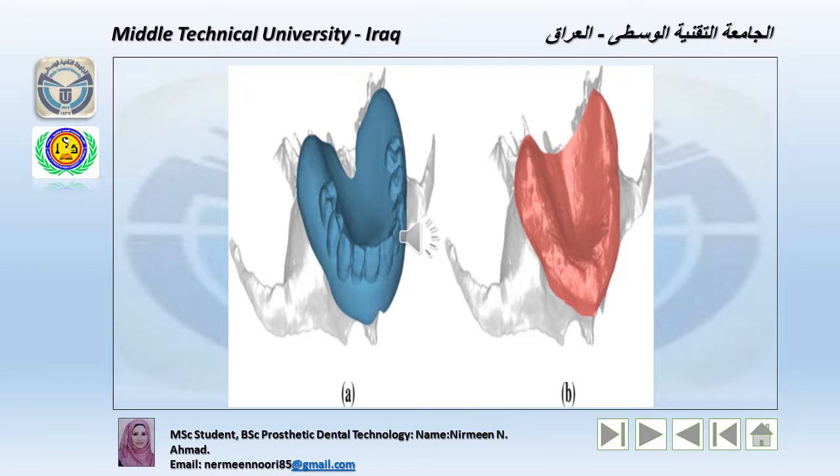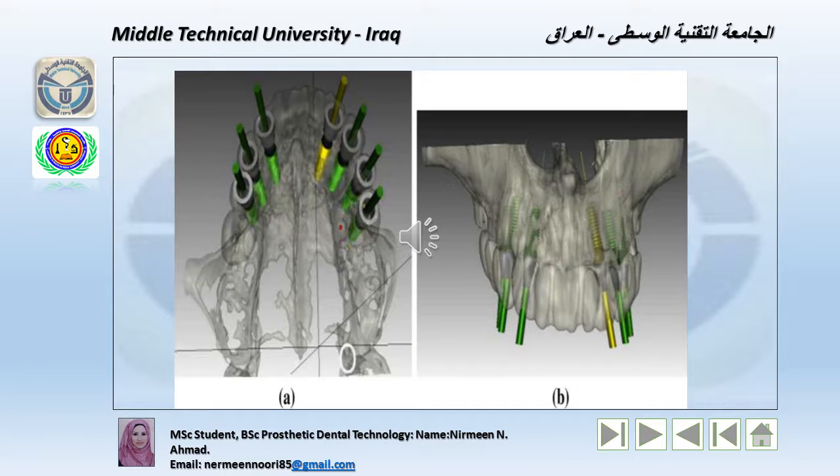In the next step, the optical and the CBCT data were geometrically matched, superimposing the radio-opaque reference surfaces and the CBCT data, and the threshold value was achieved. This slide contains two images. The two images clarify that a total of 7 implants and 3 transalveolar horizontal stabilizing pins were virtually inserted within the integrated 3D data model.